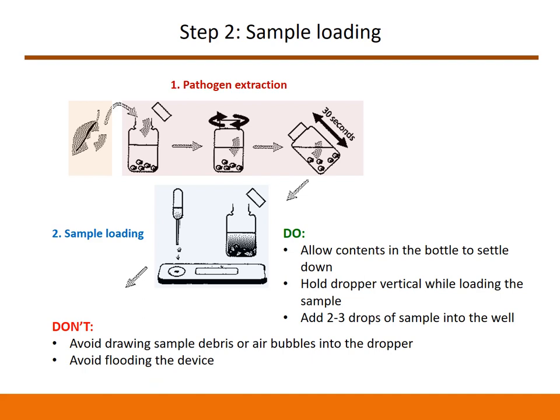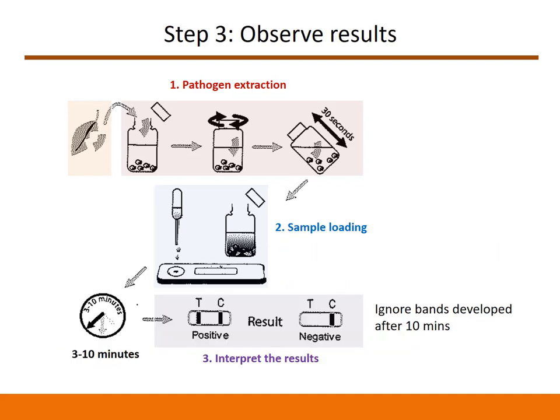Sample debris or air bubbles can interfere with the test. So after you are done shaking the bottle, let it sit undisturbed for 30 seconds to allow debris to settle down. Remove the lateral flow device from the sealed pouch and keep it on a flat surface. Using the dropper that comes with the kit, carefully draw up the liquid and start the test by adding two to three drops of the liquid to the circular sample well. Make sure you don't exceed over three drops. The result bands will start to appear after three minutes. This test is completed in under 10 minutes, so make sure to read the results within 10 minutes of sample loading and ignore any changes that may occur after this time.